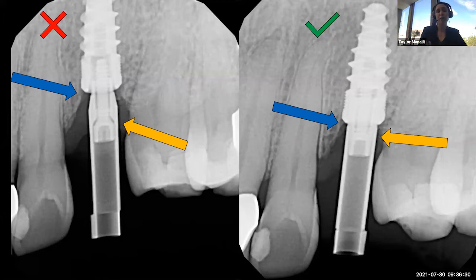If this abutment doesn't seat, your restoration is not going to seat. So regardless of what you're doing, you have to clear that soft tissue and hard tissue away from your platform, so whatever you plan on restoring is going to seat nicely in the future. All right, so this is step 1 regardless.